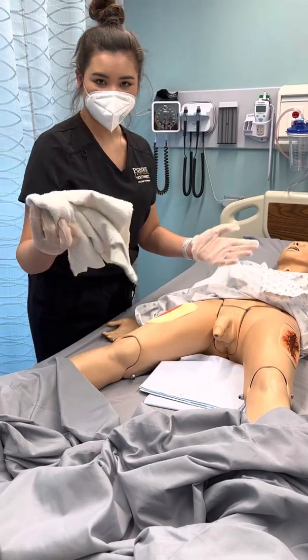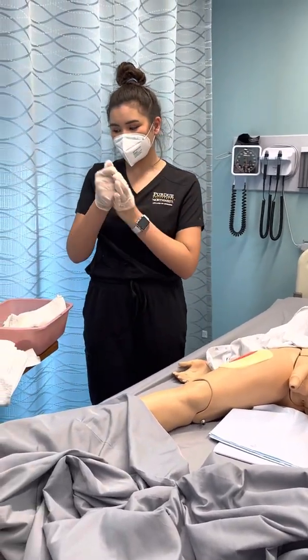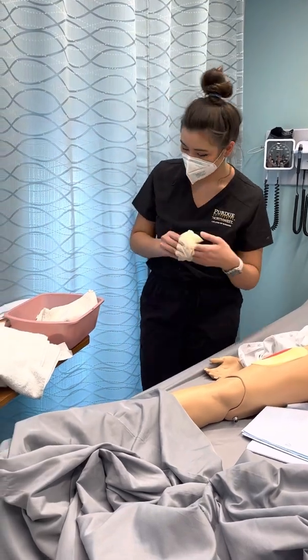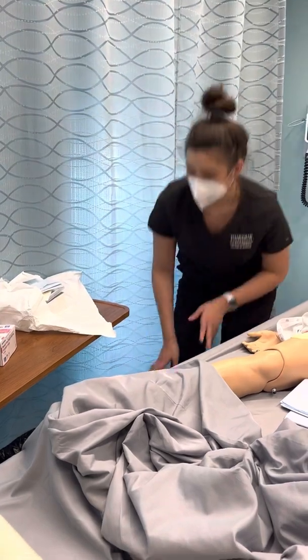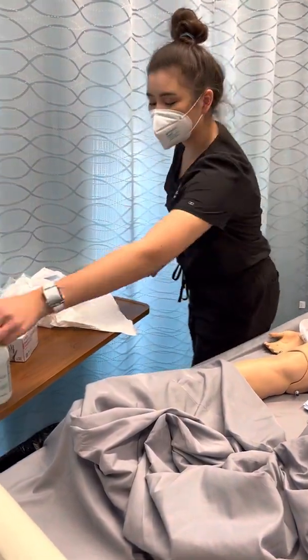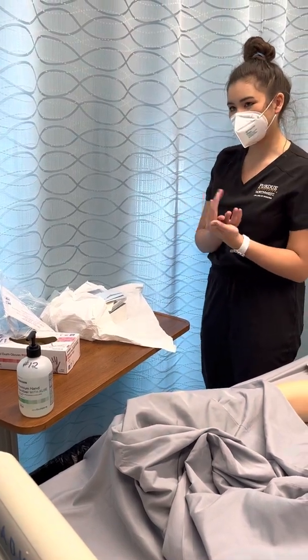So then after they're clean, I'm going to get rid of the washcloths and take my gloves off. Then I'm going to do hand hygiene again and open up our catheter kit.